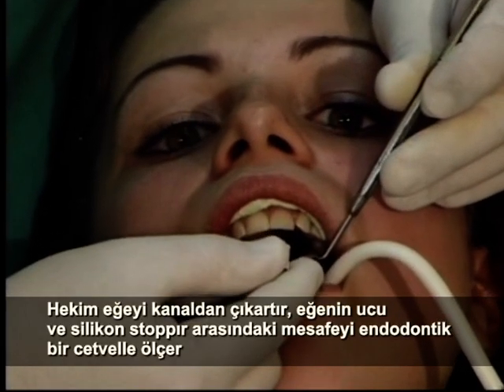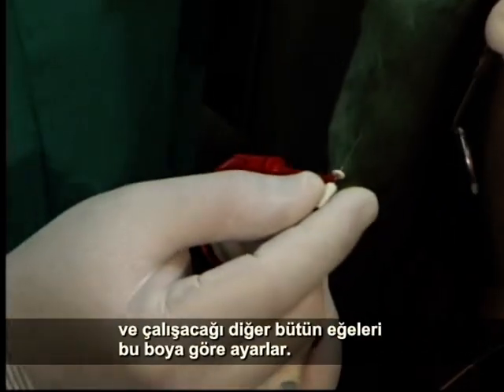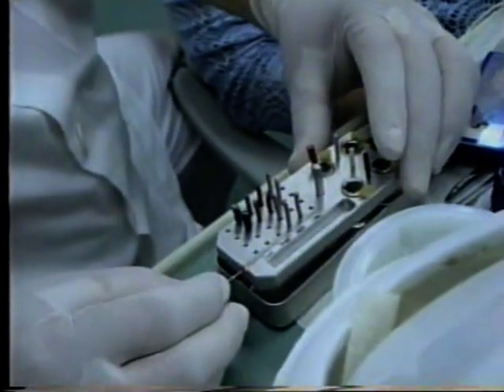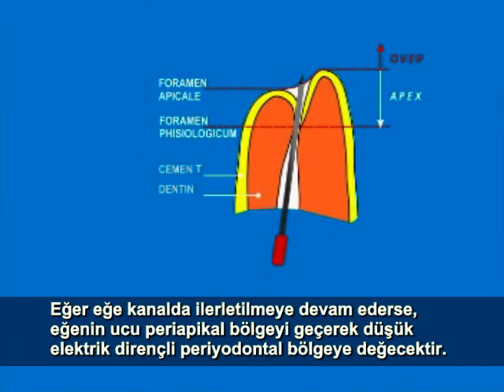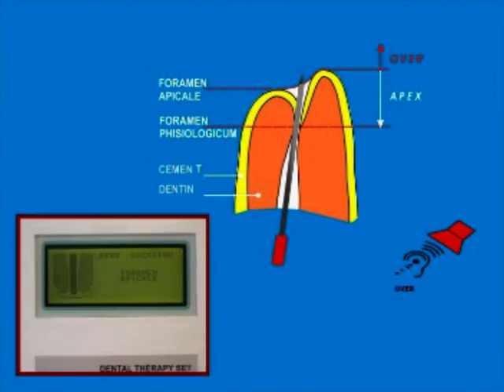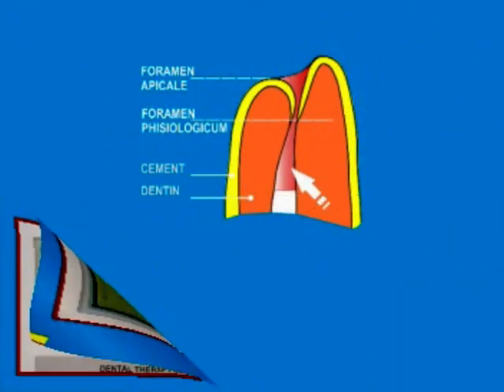The dentist removes the file, measures the distance between tip and rubber stop with an endodontic ruler, and adjusts all instruments for the work to be done. If the file continues to be inserted, the tip will pass into the peri-apical area and will touch periodontal structures with low resistance. On the screen will be shown the penetration in the peri-apical zone, and the device will generate a speech message to the dentist, over.